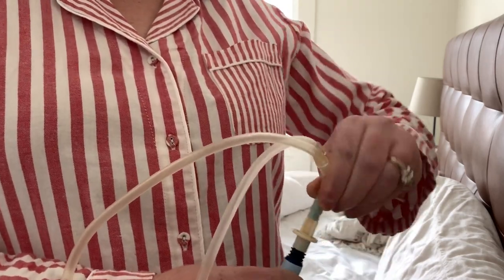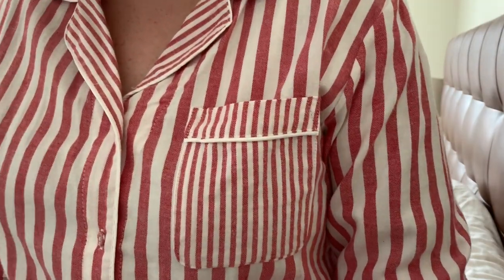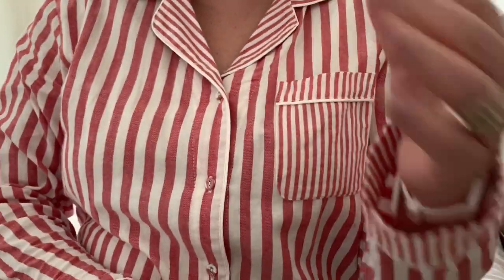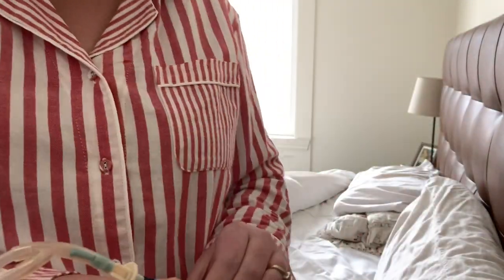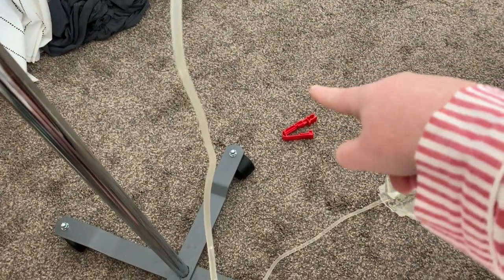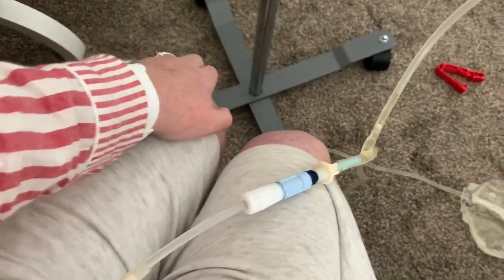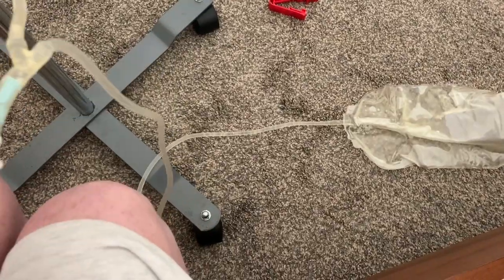Next I'm going to stand up again and break the seals, and then I'm going to take the clamp off of this one. Wow guys, this is hard to do — probably super close, you can't even see this. And then I'm going to open my transfer set and it kind of runs out like this. There's my clip that flew to the ground, and this is it going — sorry, don't look at my gross scab.